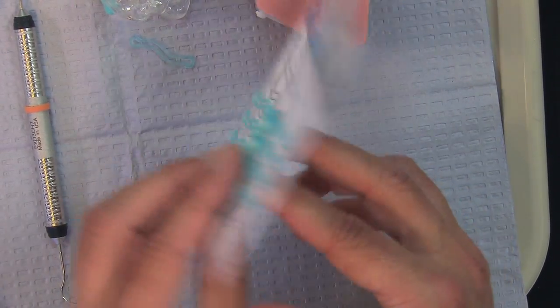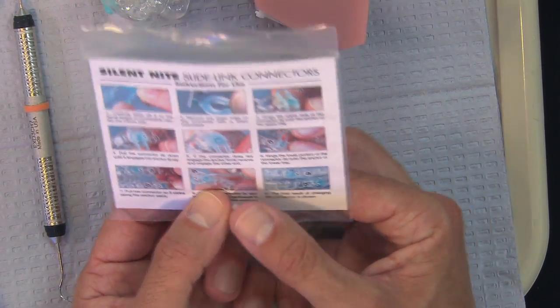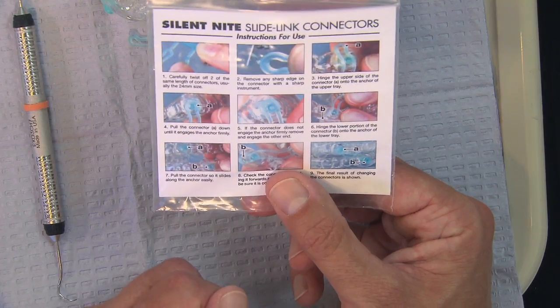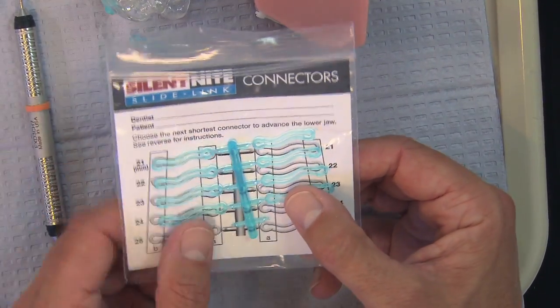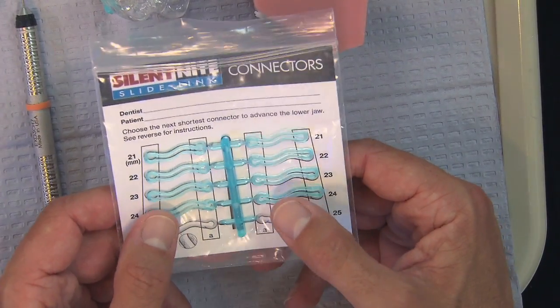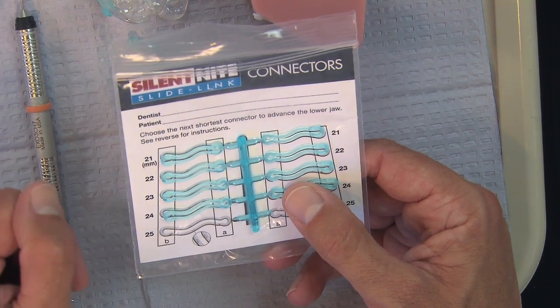So you can explain this to the patient. It's shown to them on the back as well, so if you use this as a guide as you show this to them and then demonstrate it once for them, the patient can now remove these connectors at home if they need some increased anteriorization and take care of it themselves at home. It's a nice thing for them because it saves them a trip to the office, and it saves you having to fit the patient into your schedule and be able to do it as well.